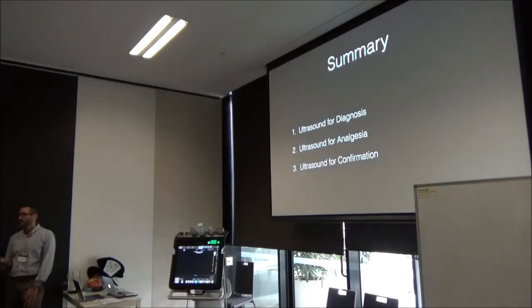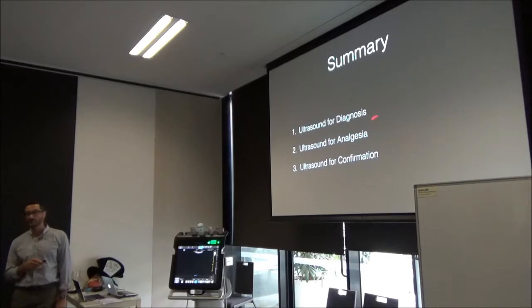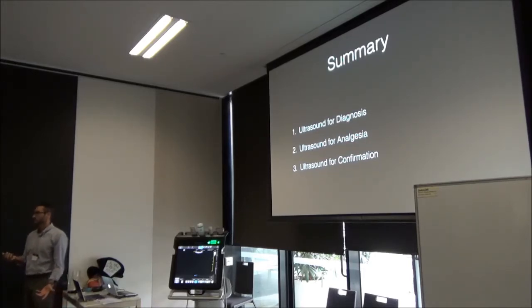So I think ultrasound is nice for the diagnosis if you need it. It's also really nice for analgesia if you like. And it helps you in the confirmation of reduction. So however you want to play this game, this is really a fun thing. Start with 1, work 2, pick 3, do what you like.